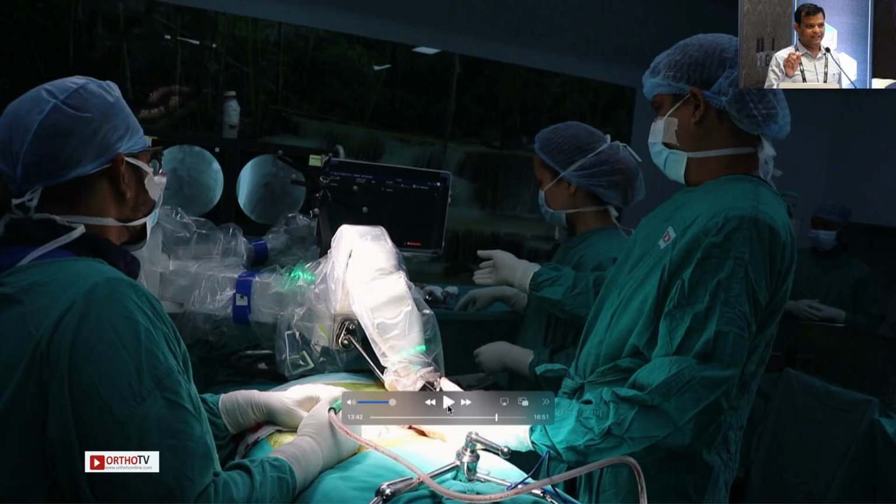So basically it's a high-speed drill connected to a Midas burr. In the initial phase when we installed the robot in 2019, the high-speed burr was not available in India, so we had a lot of issues with skiving at that time. Also, this is very important that you don't put any pressure. It should be just free for the movement of the drill, otherwise you will change the anatomy. It's like two fingers, soft touch.